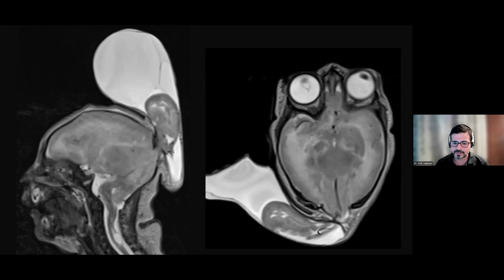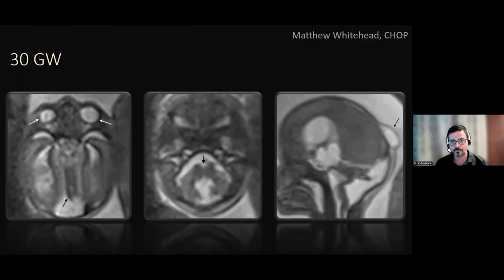Remember, when you have an occipital encephalocele of this nature, the brain generally appears to be pulled backwards, but this distortion of the brainstem is much more than you would expect with just an isolated encephalocele. And the diagnosis was confirmed. You will see this one entity basically in a lot of cases, and we have some companions from friends and colleagues where different manifestations of a similar spectrum can be encountered. But it's important to focus on looking at the brain and the morphology of the brainstem in different planes, along with the associated other findings.